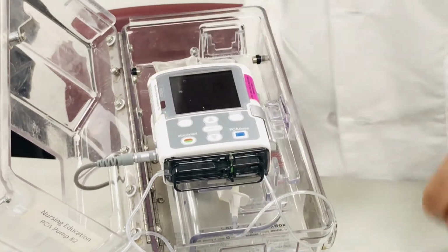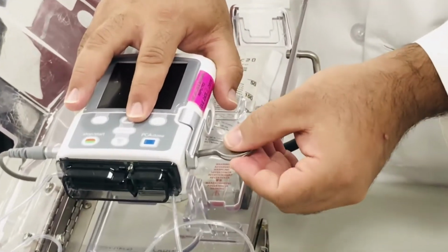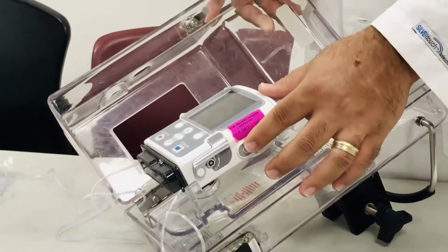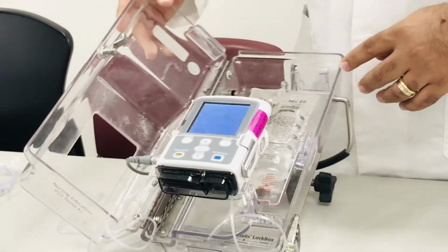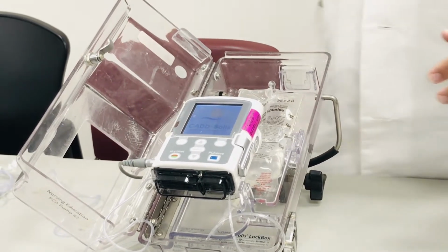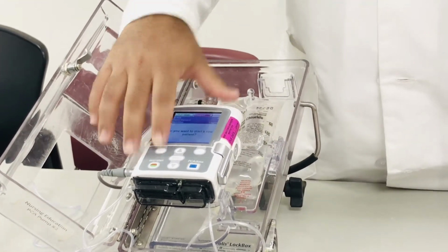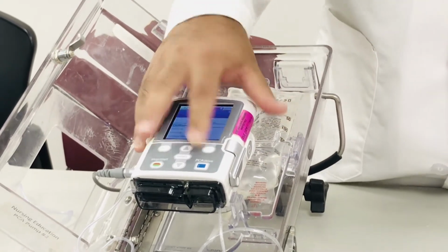Once you close the lock, the second most important thing to do is to actually lock anyone from playing with that cassette. Once you do that, you're going to press the power button. Okay? When you press the power button, you're going to follow the orders given to you and the process that needs to be done. In this case, I have a scenario, battery is low, I'm going to acknowledge it, we're going to ignore. I'm going to say I'm going to start a new patient.